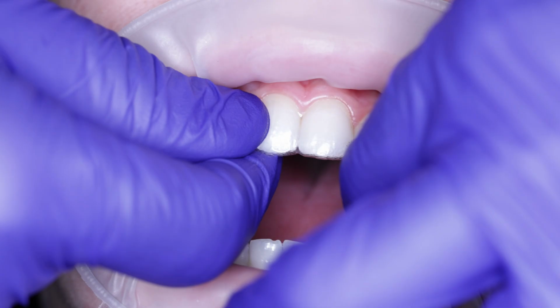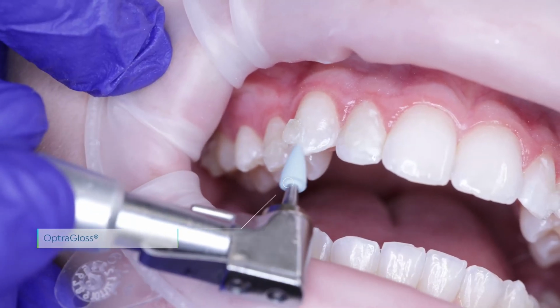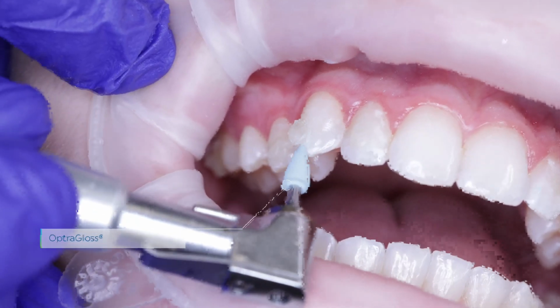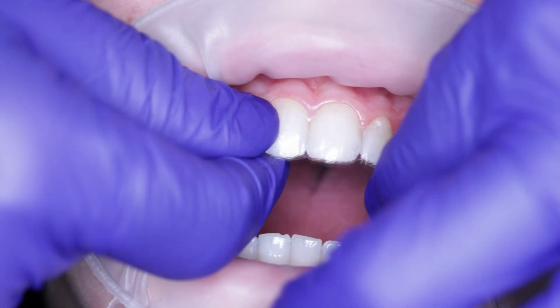After we've done the final cure, we're going to remove that template, and I'm going to pause it for just a minute. You say, Shannon, you're cheating. I am cheating. Because you know why? I don't want to have to take this off. Now remember, when we removed the attachment template, I did not acid etch the entire tooth. The reason that I didn't etch the entire tooth and actually used the Adhese exactly where I acid etched the tooth is that I don't have a whole bunch of flash and a whole bunch of cleanup. That's the beauty of utilizing the Adhese pen and only acid etching those areas.